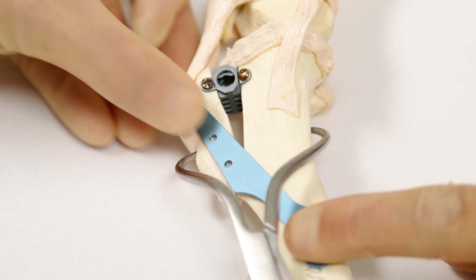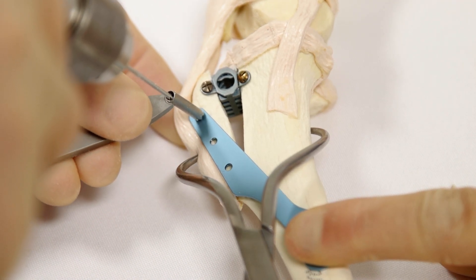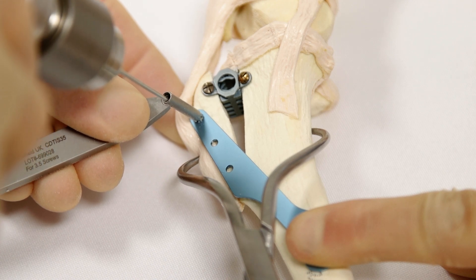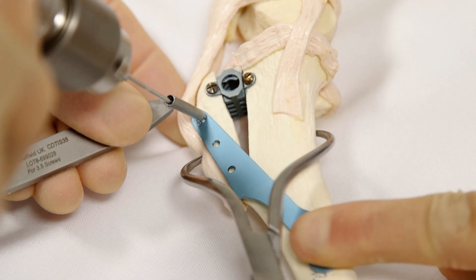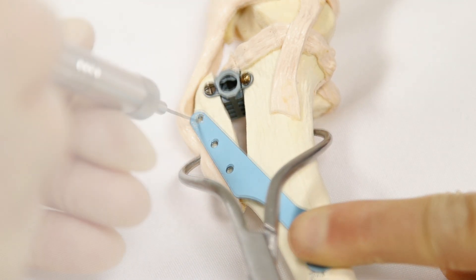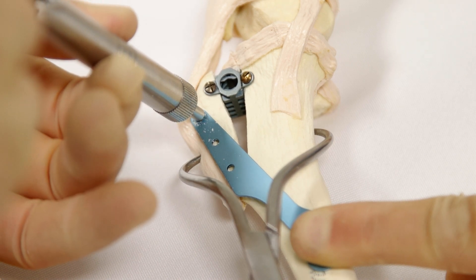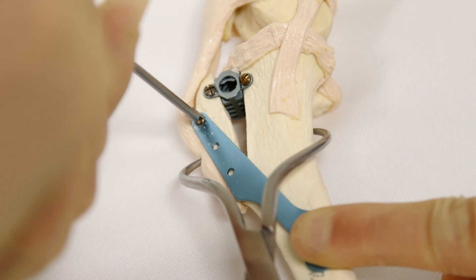Now drill the proximal plate holes in the tibial tuberosity using a 1.8 mm drill bit. Be very aware of the edge of the tibial cortex and the edge of the osteotomy, directing the drill to maximise bone engagement. Measure the depth of the pilot holes and place 2.4 mm screws, ensuring good engagement of the plate hole with the screw head.